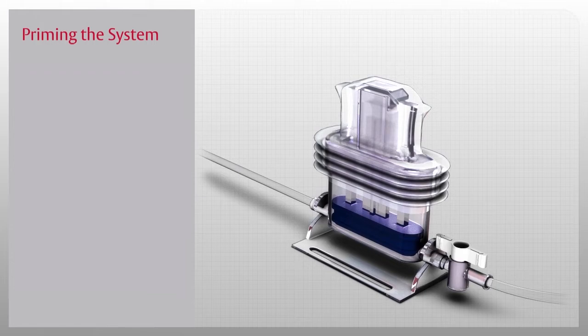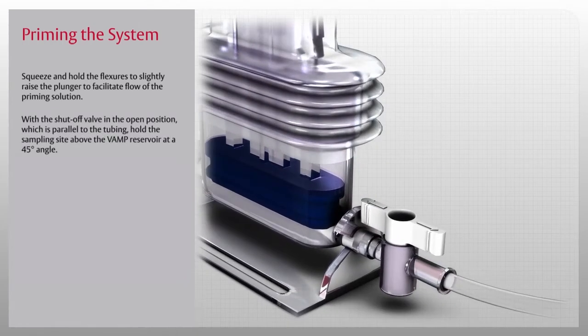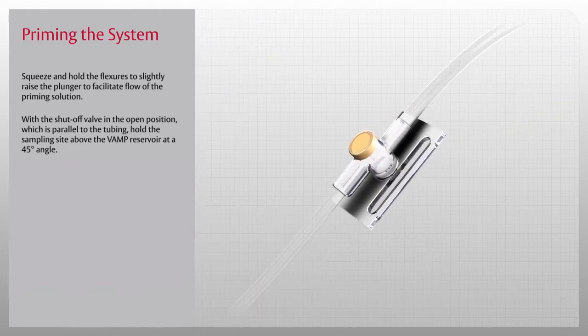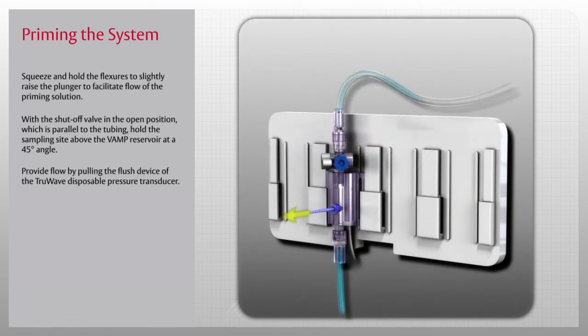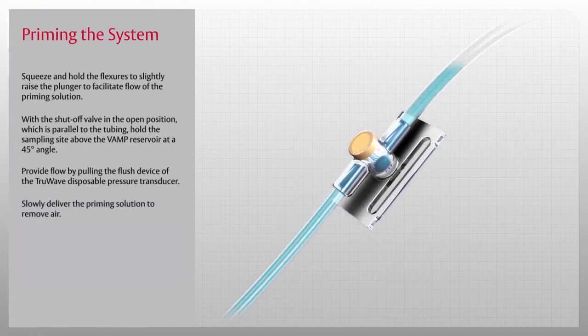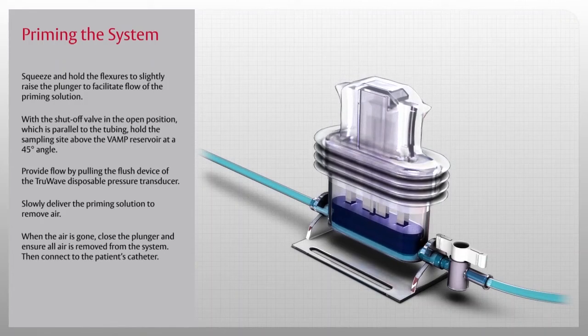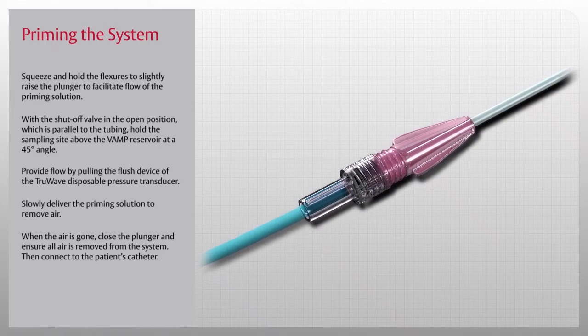The first step is priming. Squeeze and hold the flexures to slightly raise the plunger to facilitate flow of the priming solution. With the shutoff valve in the open position—parallel to the tubing—hold the sampling site above the VAMP reservoir at a 45-degree angle. Provide flow by pulling the flush device of the TrueWave disposable pressure transducer, and slowly deliver the priming solution to remove air. When the air is gone, close the plunger, ensure all air is removed from the system, then connect to the patient's catheter.